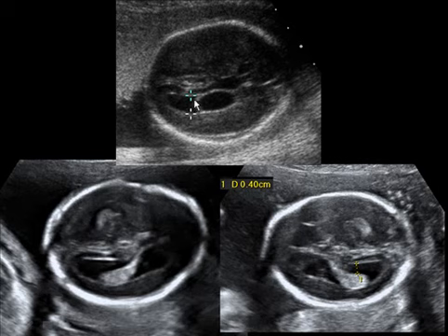This is the down ventricle, and we see a choroid here, and then the calipers sit in the atrium of the lateral ventricle along the medial edge here and the lateral edge here. Here is an example of the dangling choroid, where the choroid is separated from the medial wall of the lateral ventricle, and we can measure this distance from here to here. If you see as much as 3 millimeters, it suggests that there is underlying ventriculomegaly. And again, this is useful early in gestation where the 10 millimeter cutoff might be a little bit too big.